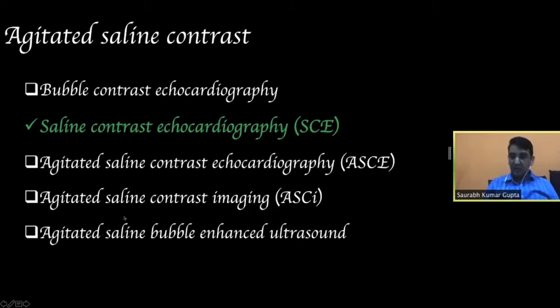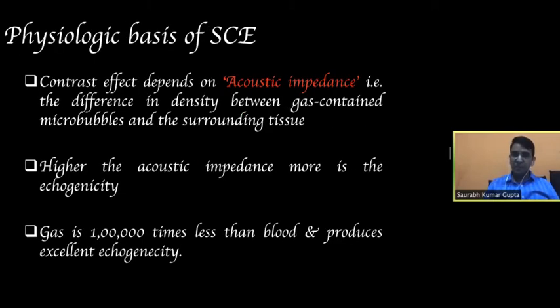The rest, I guess, is confusion, but they all are prevalent in the literature. Now, what is the physiological basis of saline contrast echocardiography? The contrast effect depends on the acoustic impedance, that is the difference in the density between gas-contained microbubbles and the surrounding tissues. The higher the acoustic impedance, the more the echogenicity.